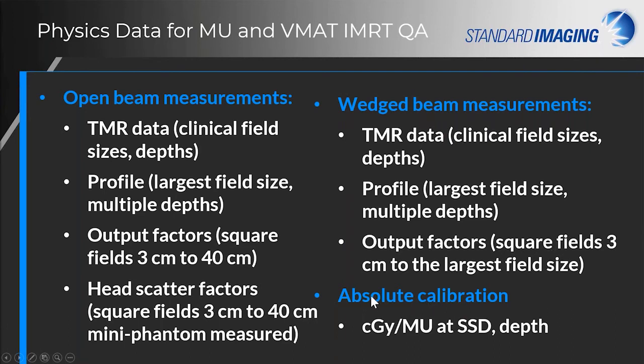As well, one requires the absolute calibration. And of course, the conditions under which that absolute calibration is required, the SSD and depth. As well, for an electron model, similar data is required.